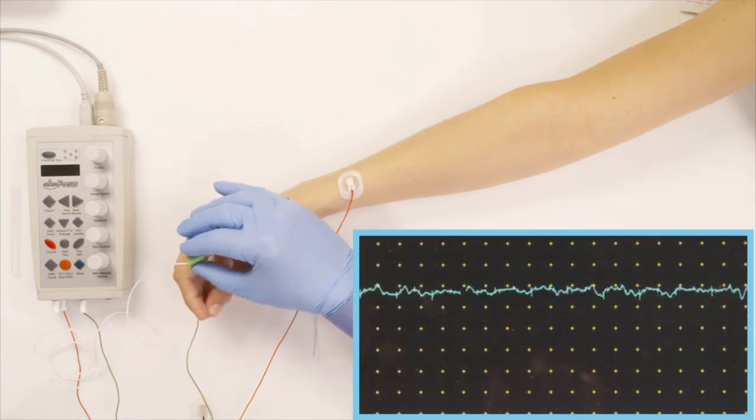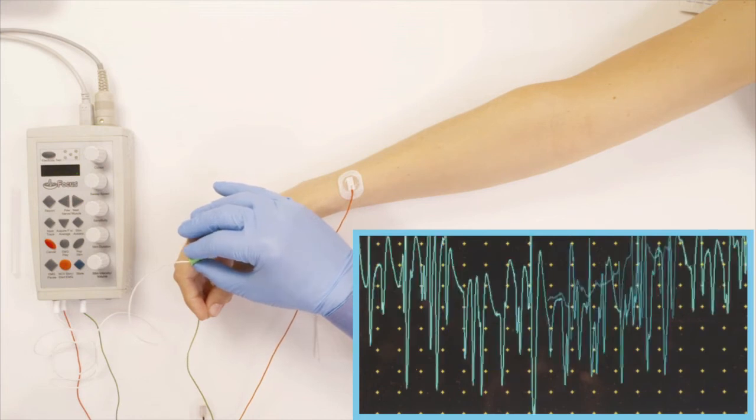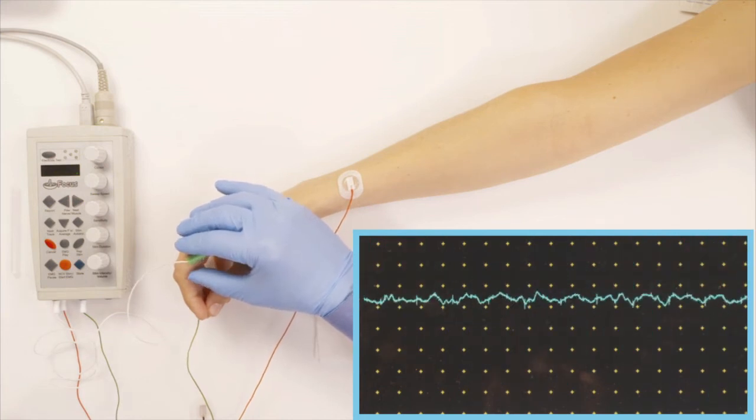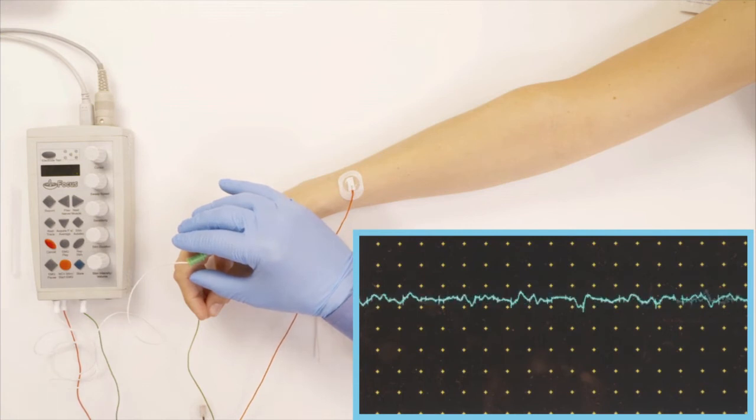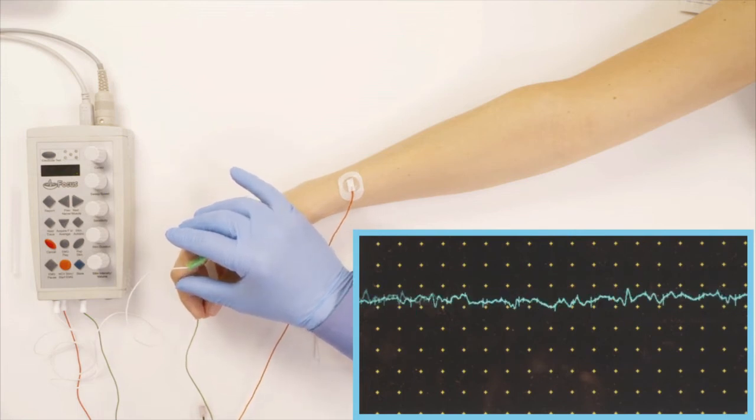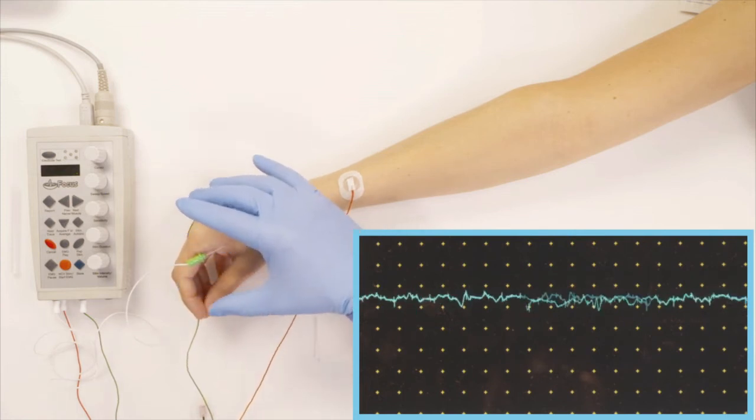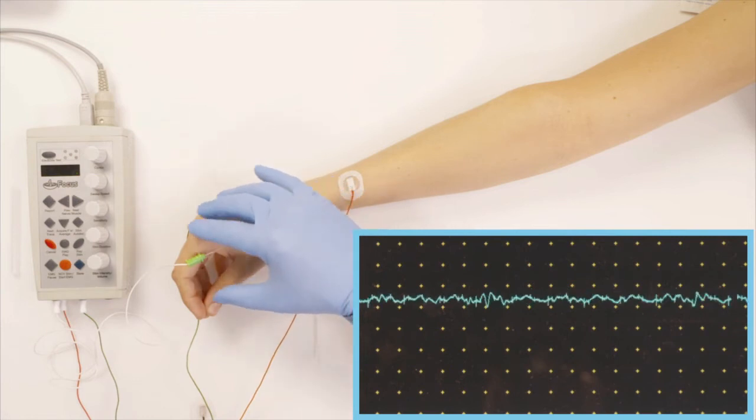You see some spikes and they stop as soon as I stop. If they continue, that means that there's unusual activity in the muscle. Sometimes they continue because you have the needle close to the area where the nerve enters the muscle. That's not bad. But if they continue and you're away from the area where the nerve enters the muscle, that means those are fibrillation and positive waves. And that means that there is denervation, that the muscle lost its nerve supply.